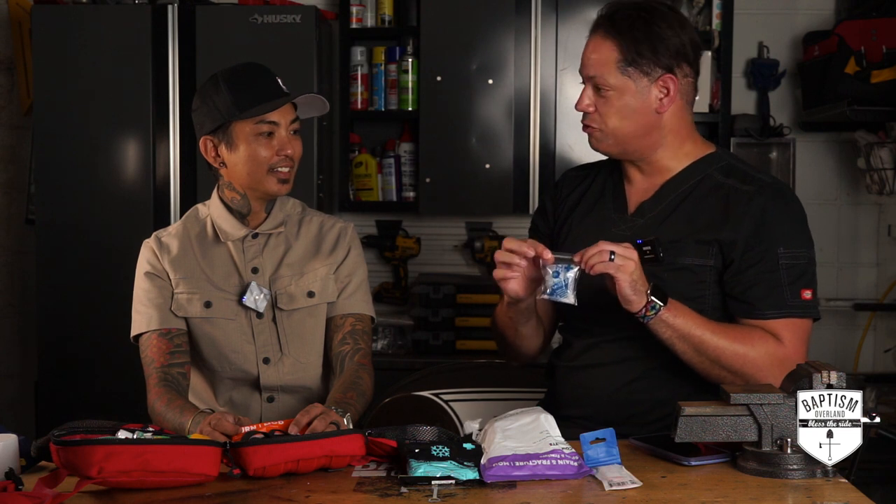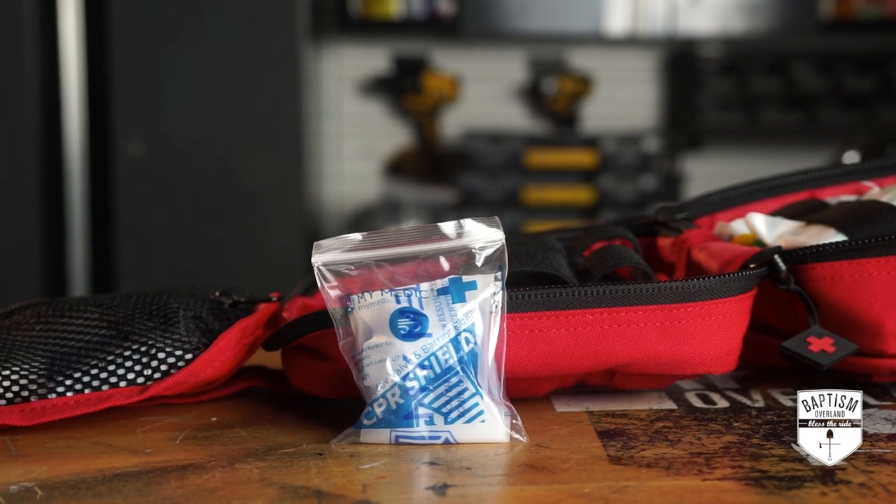This is a CPR shield — you put it on someone's mouth. In the wilderness we're taught to just do mouth-to-mouth if somebody's not breathing, but with this you insert it into their mouth and push air through it. So you don't have to put your mouth directly on them — it's mouth to plastic.